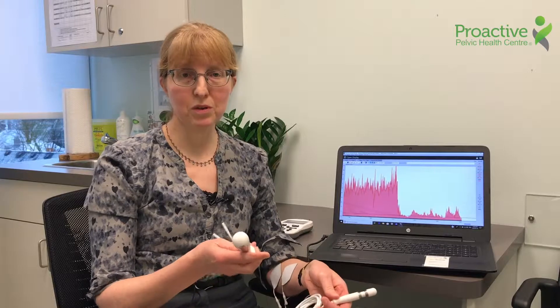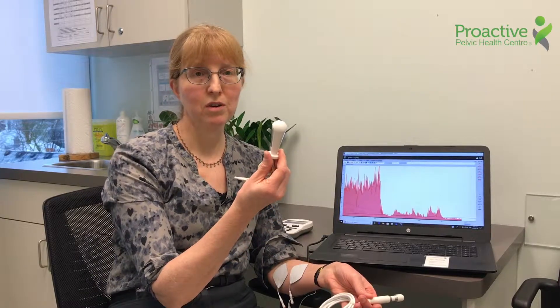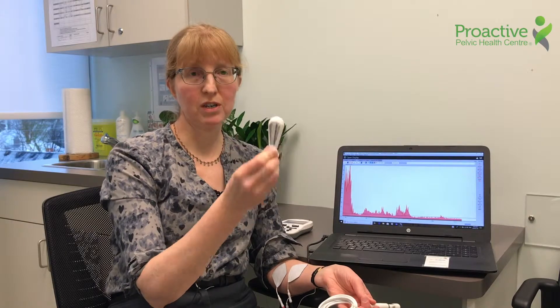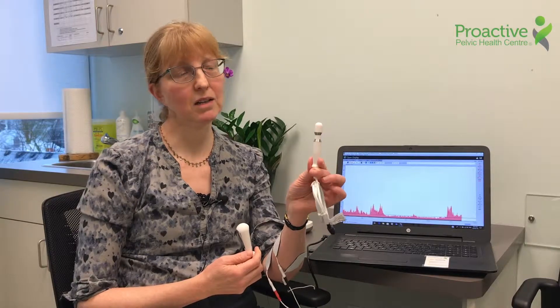There are two kinds of probes that we use internally. I've got a vaginal probe here to show you, and those are for one person — you get the probe, we use it with you, wash it, and you take it home and bring it back again. A rectal probe is exactly the same idea, just a little bit smaller.